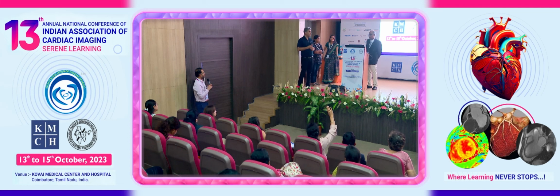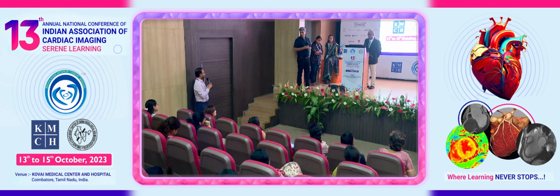But they ask for the measurement distance between the RVOT and the coronary. Should it be in diastole or systole or both? We provide both. And the minimum distance? Minimum distance. Thank you.